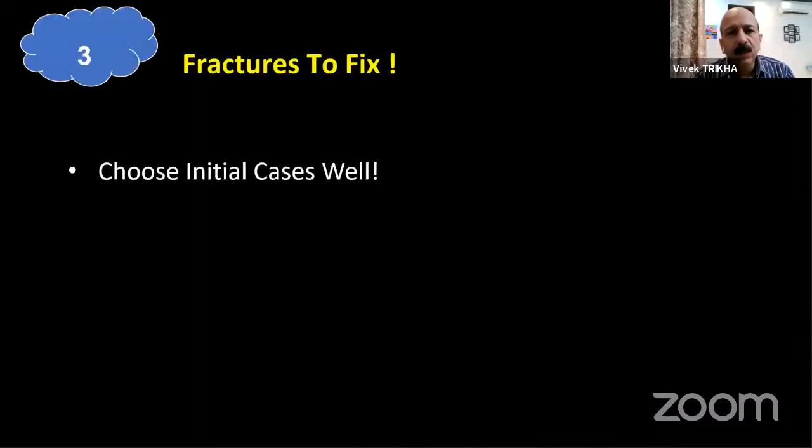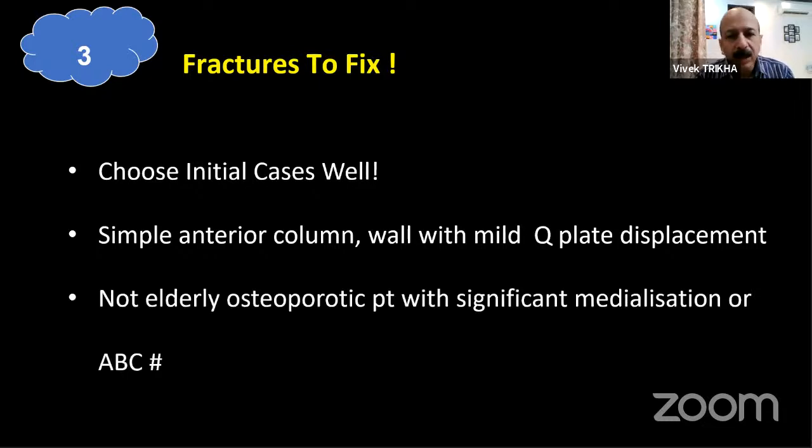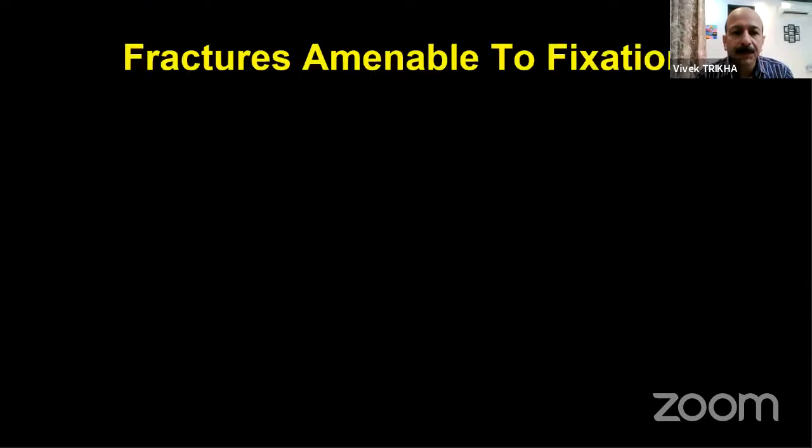So now it brings us to which fractures we can fix through this intrapelvic approach. In my experience, I would say choose your initial cases well, otherwise you will be disheartened. Take simple anterior columns with mild quadrilateral plate displacement in young patients as your first cases, not the elderly osteoporotic patients, which we have seen over the last three presentations by Dr. Rommens, Dr. Sen, and Pradeep. They should not be the first cases. Otherwise, sometimes you will have failures which will dishearten you.